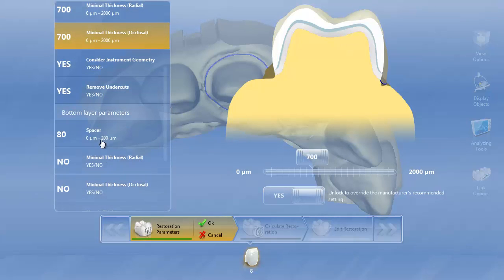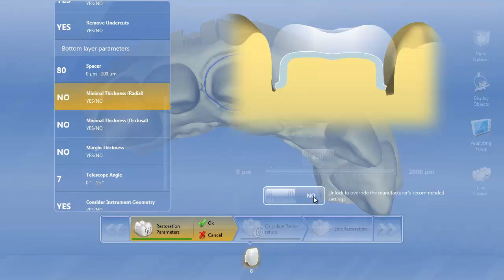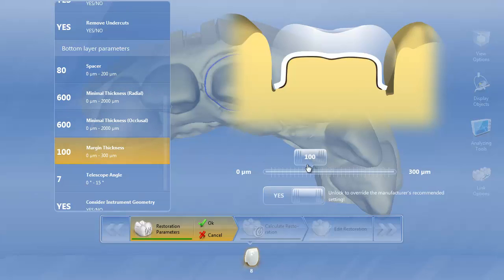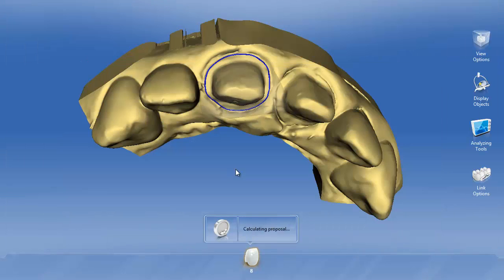Now we'll go to the bottom layer parameters. Generally I like my bottom layer parameters to be a little bit different, because in these very deep situations where we're creating this multi-layer restoration, I'm probably going to cement the coping with resin modified glass ionomer. So I want my spacer to be a little bit tighter because we want it to be a tight fit — we're not bonding it. The minimal thickness I like to be a little bit lower as well. The margin thickness and telescope angle look good, so we'll hit OK.